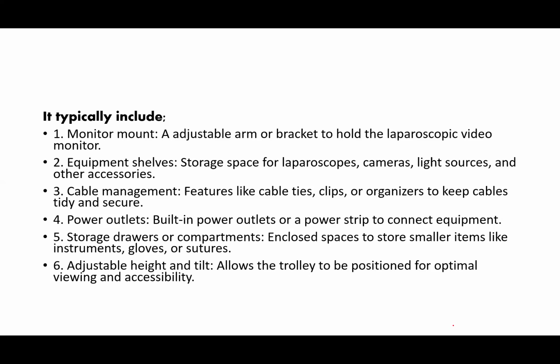Now, cable management is what we just discussed. Features like cable tie clips or organizers keep cables tidy and secured. All the cables are clipped. If the trolley is well packed, you won't even see all the cables because they will be packed in a slot behind the trolley.